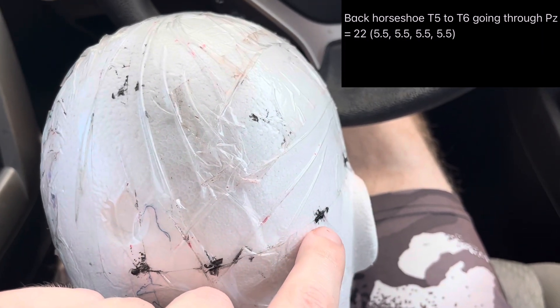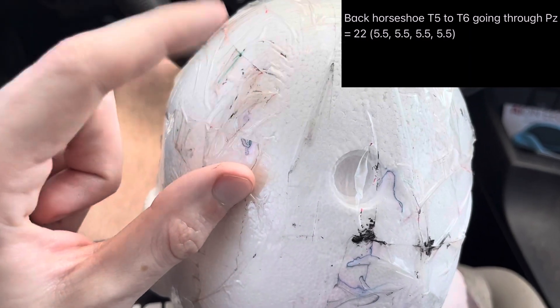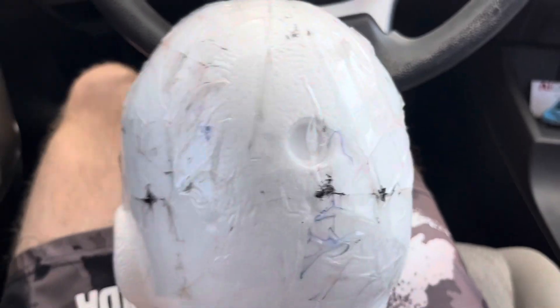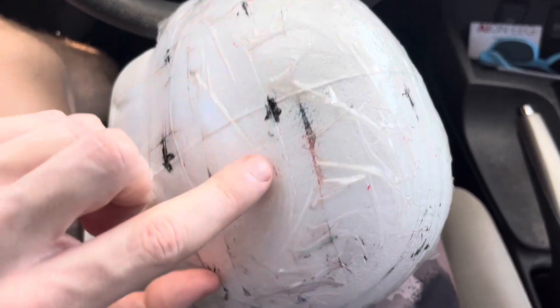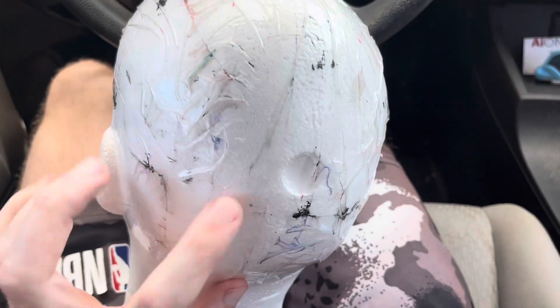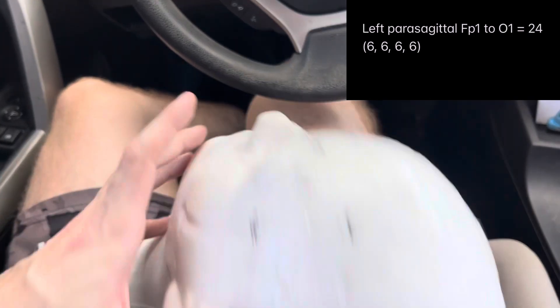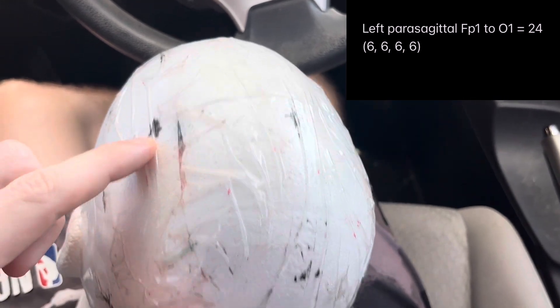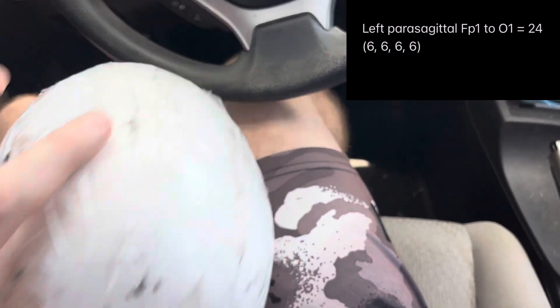Now the back horseshoe: from T5 going through Pz all the way to T6, again all 5.5 cm spacings — T5 to P3, P3 to Pz, Pz to P4, and P4 to T6. Then the left parasagittal line goes from FP1 through all the marks down to O1. Let's say that's 24 centimeters, so FP1 to F3 is 6 cm, F3 to C3 is 6 cm, C3 to P3 is 6 cm, and P3 to O1 is 6 cm.